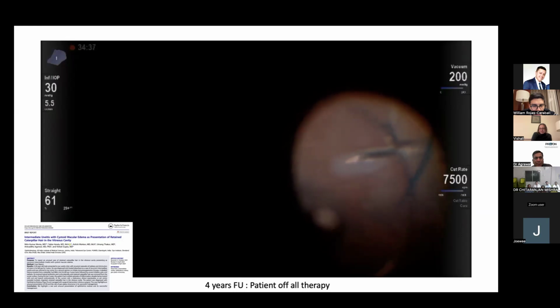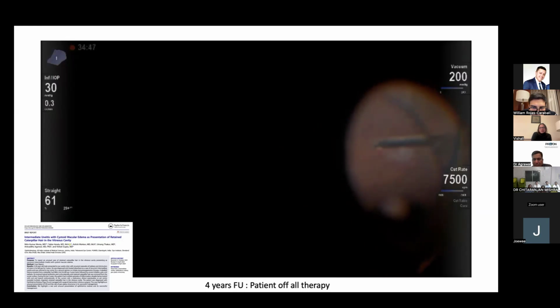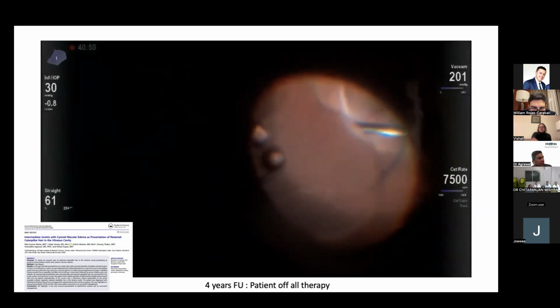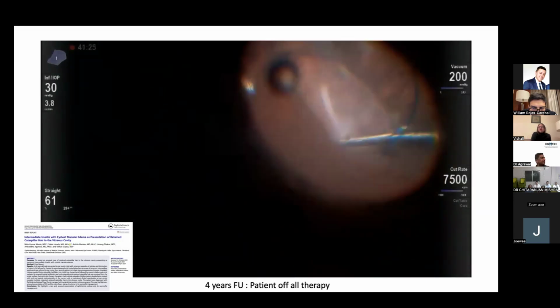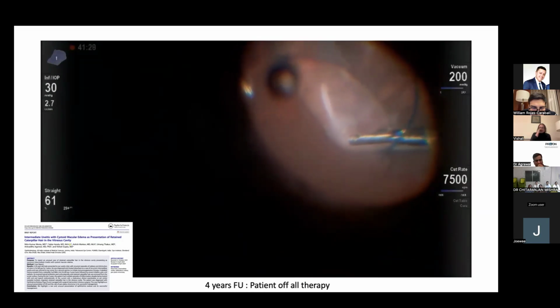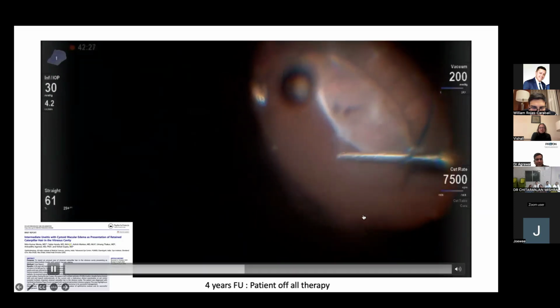So you can see this one here. It has got the vitreous opacification around it. It was easy to cut it with the cutter. There was another one which was sitting on the surface of the retina, this one, and it was kind of in the base. You can see the ora serrata out there. So I had to tease it out with the forceps and remove it.